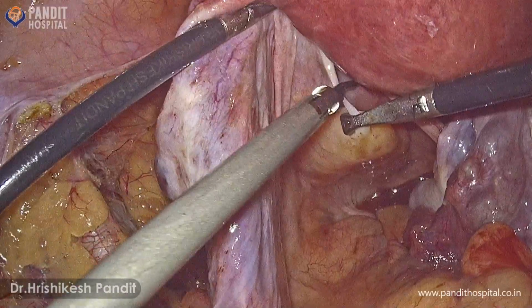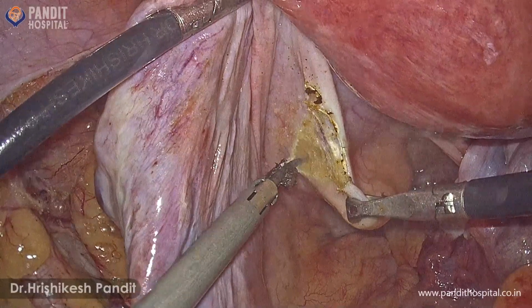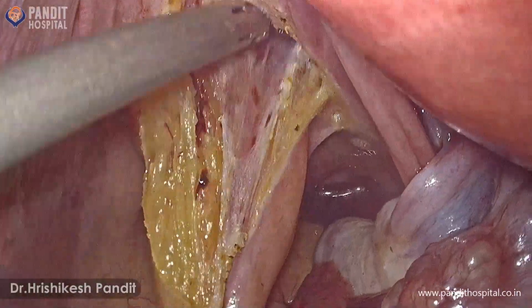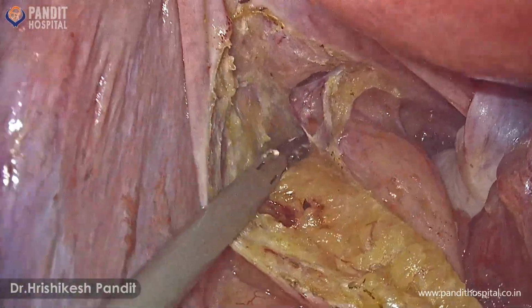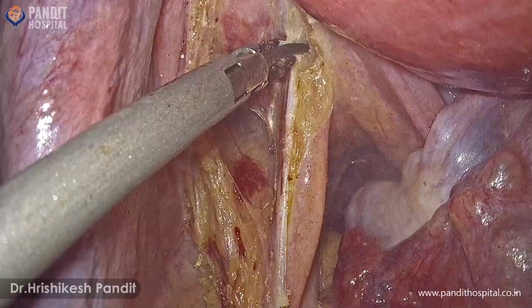It contains Denonvilliers' fascia, which is a two-layered fascia between the rectum and the vagina. The assistant is giving tenting traction on the rectum so as to create bubbles and help in dissection. This step is important to remove an adequate tumor-free posterior margin of the vagina.